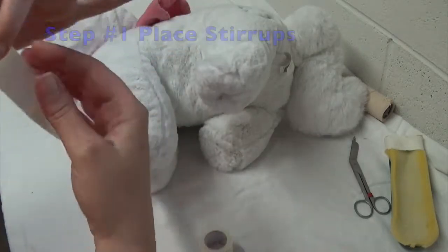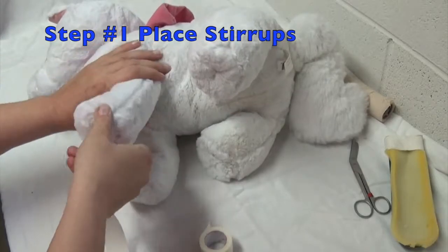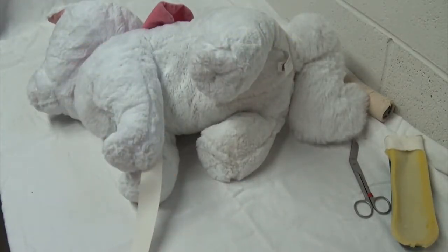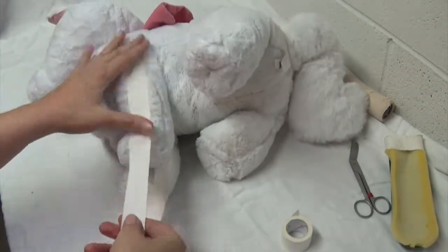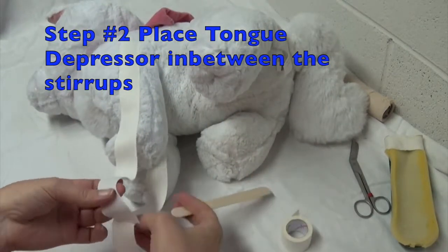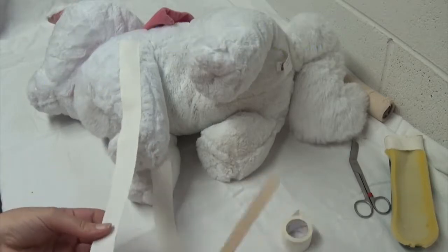The very first step is going to be your stirrups along the lateral aspects of the patient. Then your tongue depressor to prevent the tape from sticking together — just like that.